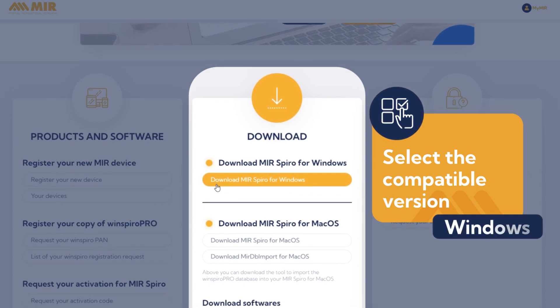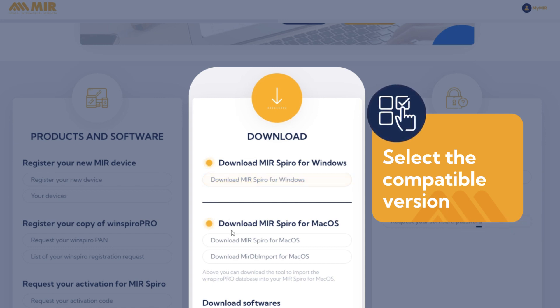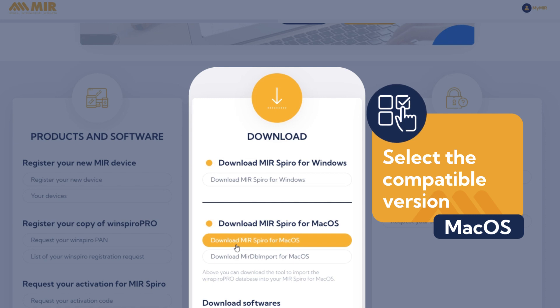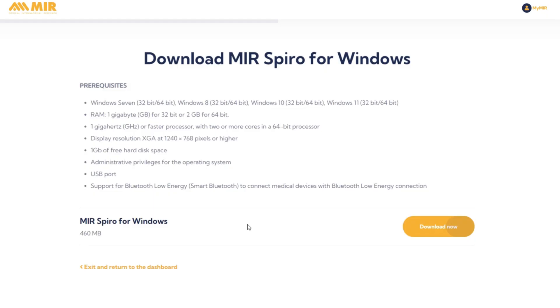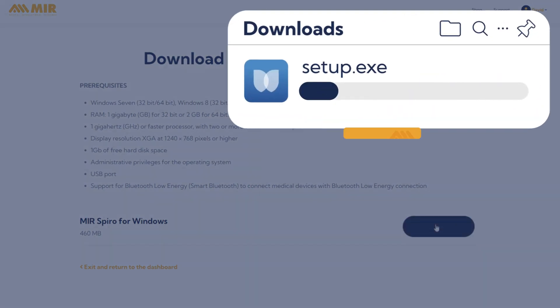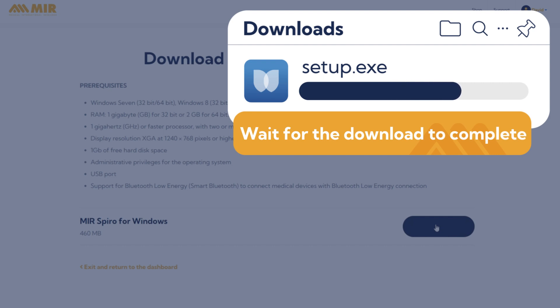If you have a Windows operating system, select Download MIR Spiro for Windows. If you have Mac OS, select Download MIR Spiro for Mac OS. Wait for the download to complete.